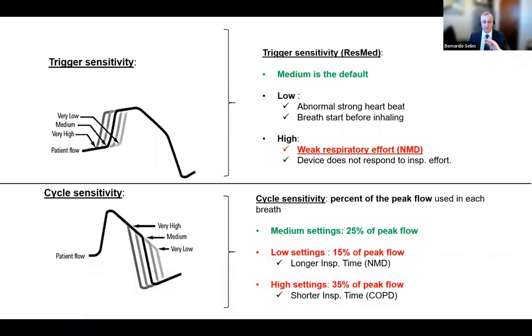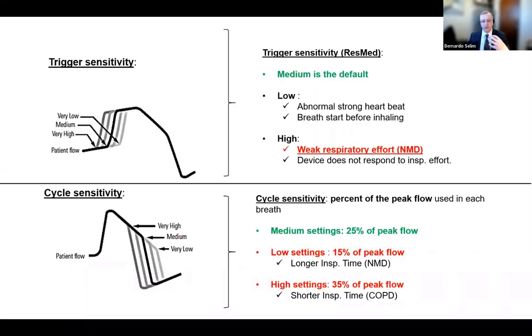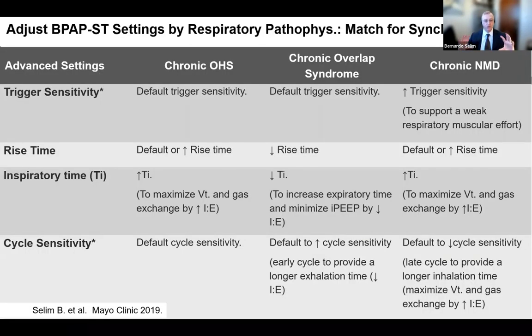And you're going to say, oh my God, this is too complicated. I never ever in my life am going to change any of these things. Well, the purpose of this talk is for you to be aware of this component and what they mean. It doesn't mean that right now you're going to go to your clinic and change all of them. The second part is that you need to understand that they will change the way that your patient synchronizes with your machine. And when you return back to this talk later, when it has been recorded and posted, I will invite you to see this table and try to understand the concept that I have been explaining to you and how these can be changed.